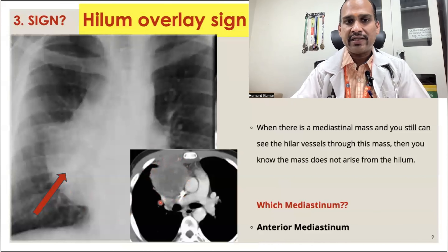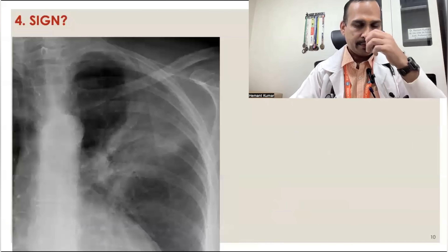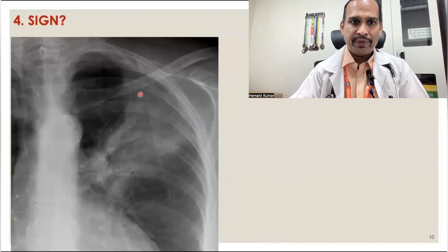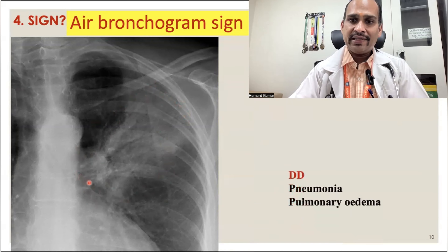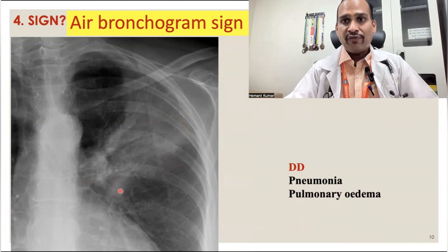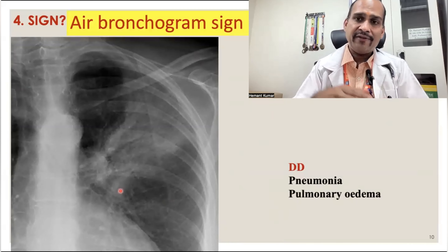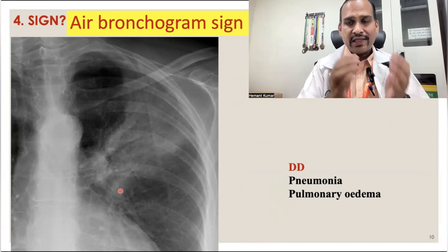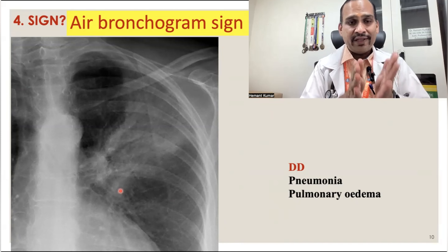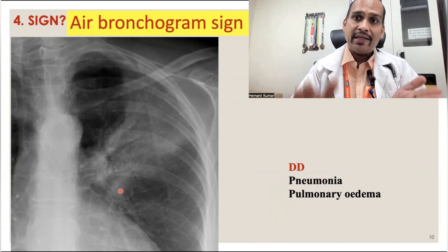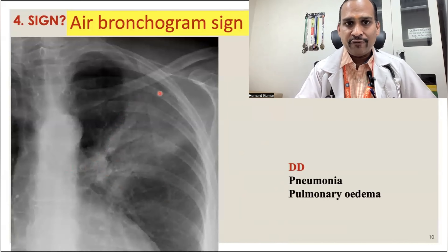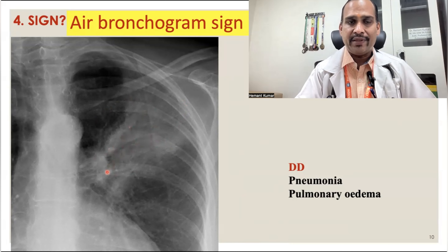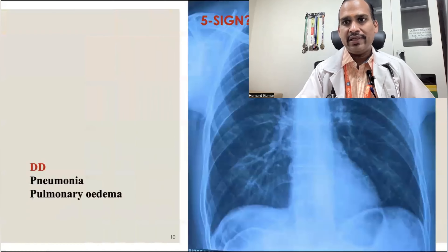Sign 4 is the air bronchogram sign. It is seen in pneumonia or pulmonary edema. Whenever there is filling of alveoli — either by fluid or by exudative material — the alveolar part gets consolidated. But the airway remains patent, and because air is inside the airway, it gives a black shadow. So in white opacity, you can see black branching structures in between — this is the air bronchogram sign, commonly seen in pneumonia.